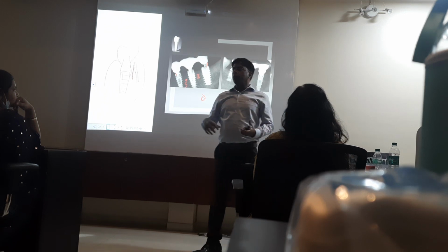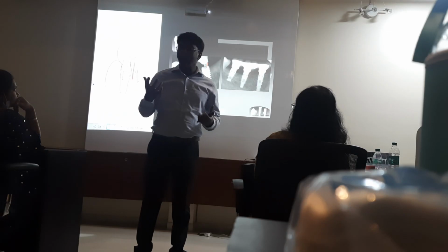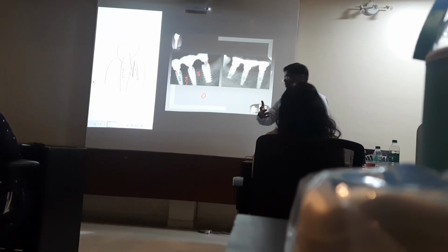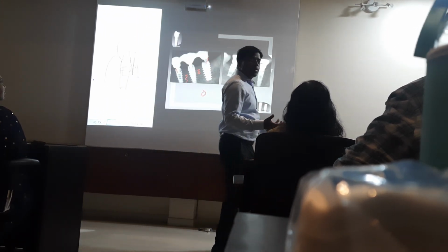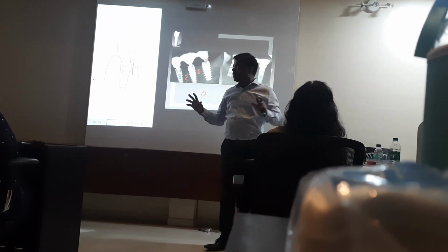Now this is a problem which happens. You have placed an implant and crown for a patient and the patient is coming to you after a year, and the patient will say, sir, it is moving. Moving means, definitely what do you think? Implant. Yes, you are worried. So, come, sit. We will take an X-ray. In the X-ray, to your luck, you will see that the implant is good. Bone is fine, implant is good.